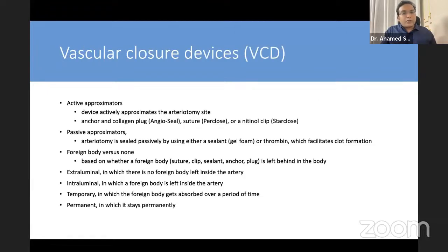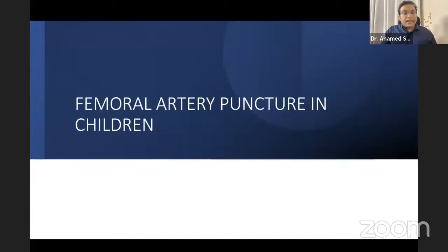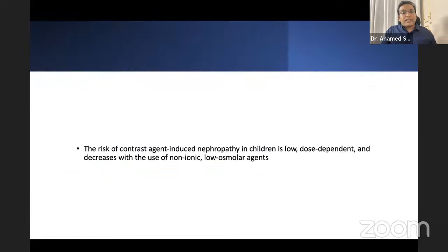And vascular closure devices and assisted compression devices can be used. And in children, the risk of contrast-induced nephropathy is less.